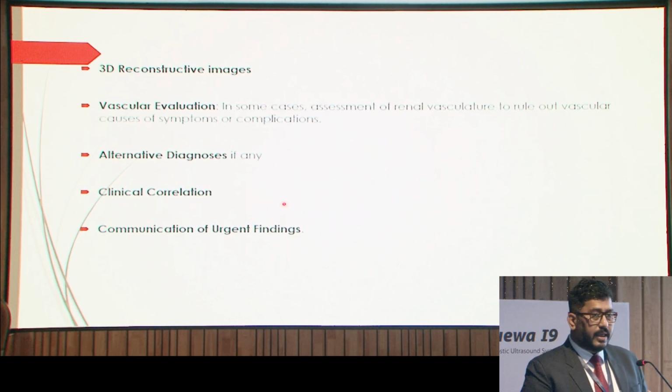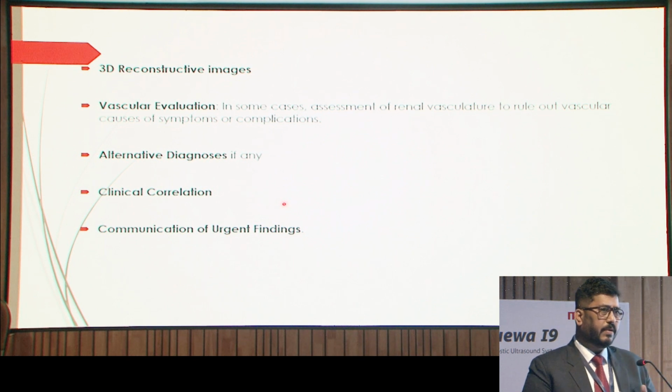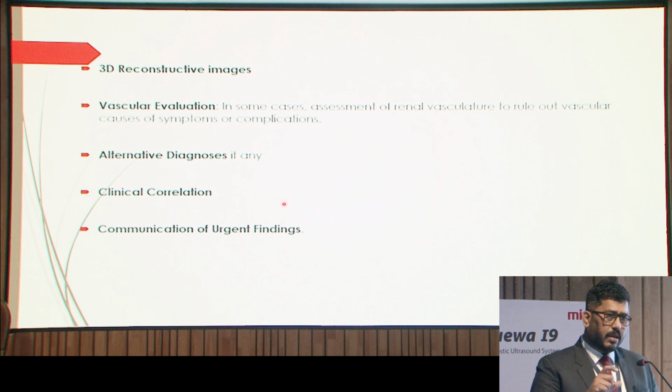A 3D reconstructive image can really help us. In this image, if the contrast color is faded and the stone is made brighter, then we can have a better picture of the pelvicalyceal anatomy in relation to the stone, where exactly the stone is.